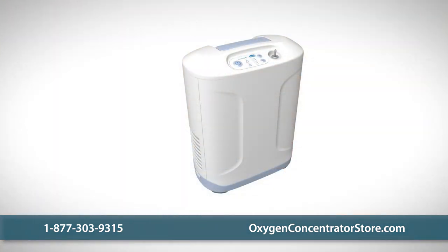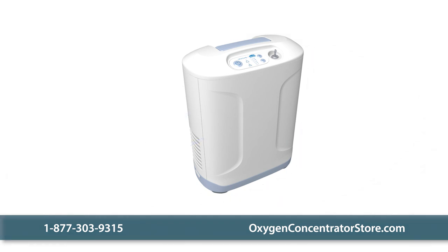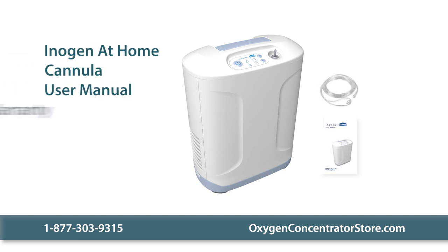One of the most versatile home concentrators, the At Home is 13 inches wide, 7 inches deep, and 16.5 inches high. Your purchase includes the Inogen At Home unit, a cannula, and a manual, as well as a three-year warranty.